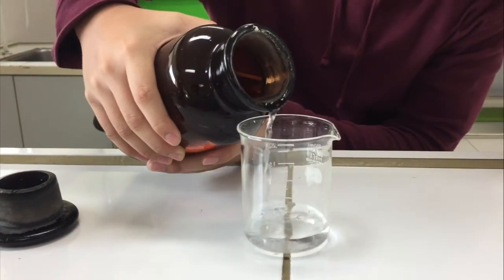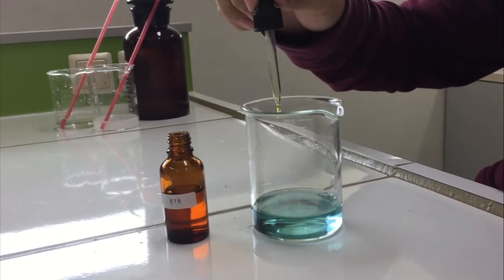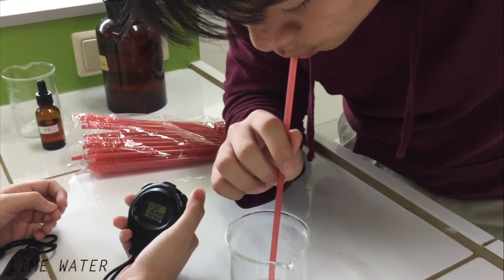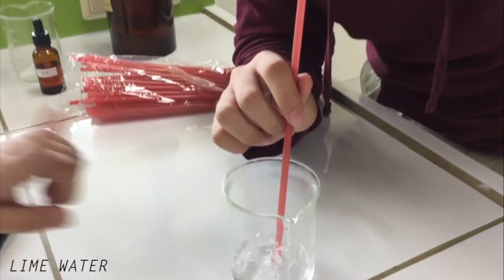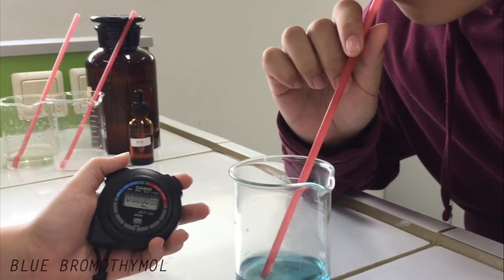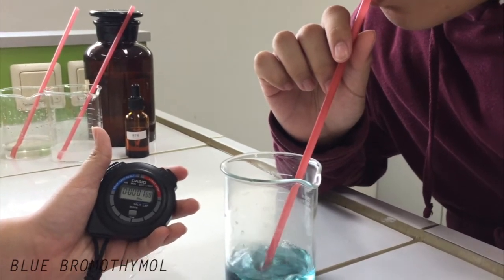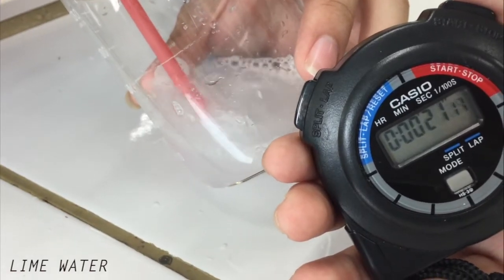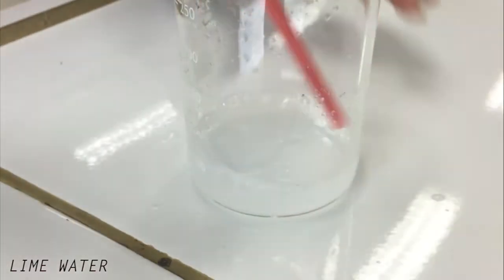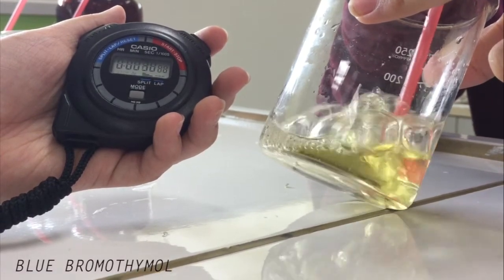1. Pour 50 milliliters of lime water and blue bromothymol in 2 separate beakers. 2. For each beaker, blow each liquid using a straw. 3. Observe the results. If lime water turns cloudy, CO2 is present. If the bromothymol solution turns from blue to green or yellow, then CO2 is present.